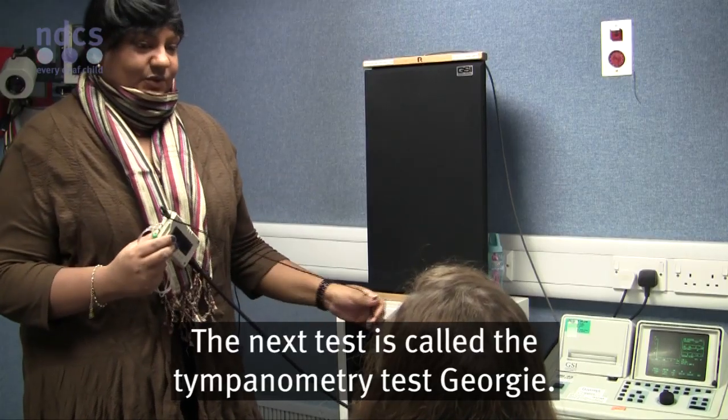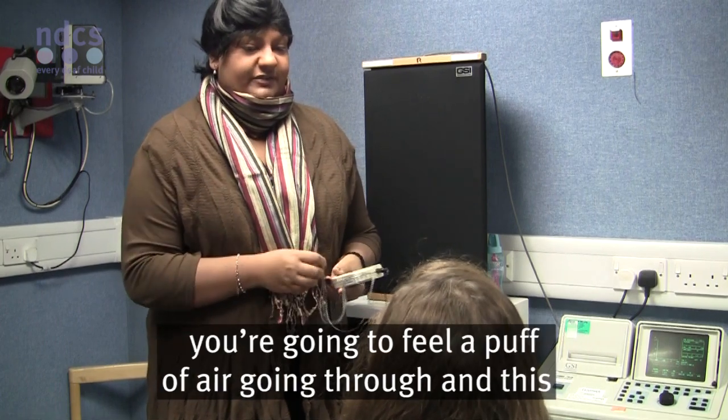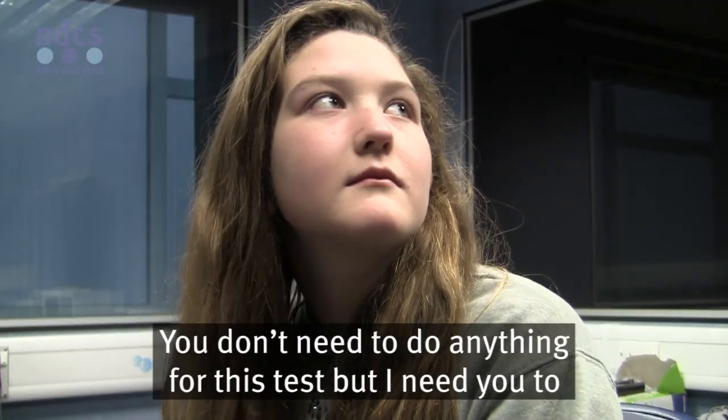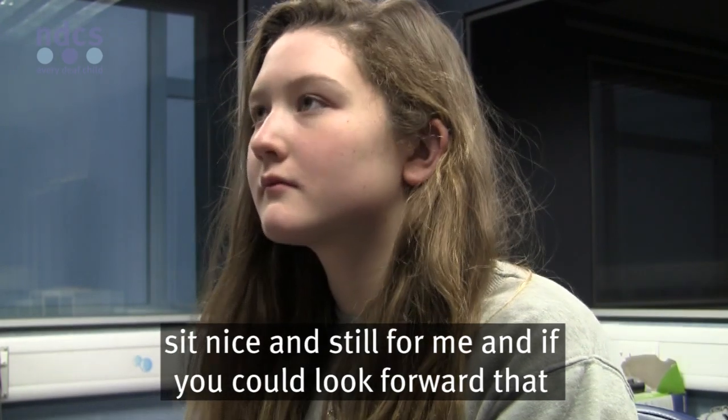The next test is called the tympanometry test, Georgie. What I'm going to do is put a little tip in your ear, and you're going to feel a puff of air going through. This machine is going to tell me how well your middle ear is working. You don't need to do anything for this test, but I need you to sit nice and still and look forward.